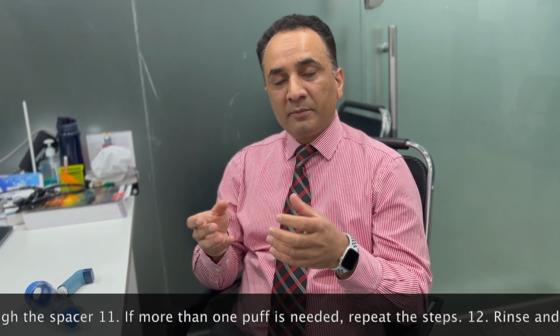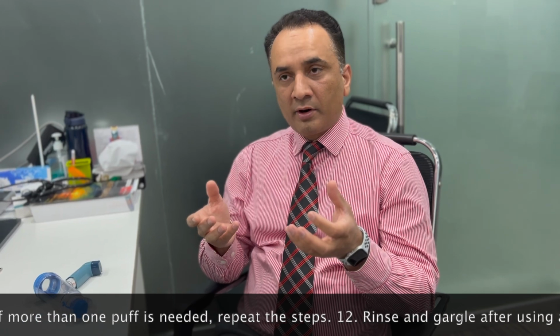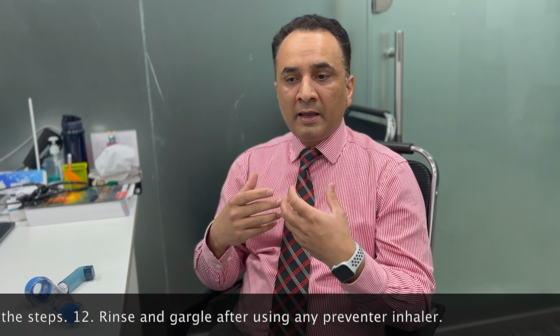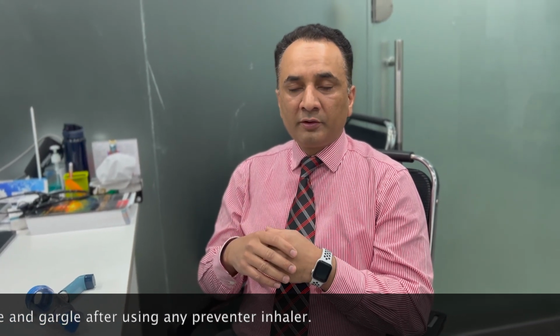If you have used any preventer with steroid in it, we recommend that you gargle, rinse, and spit out afterwards, so that you reduce the quantity of medication that is stuck to the throat and the tongue area, to reduce the complications or side effects.